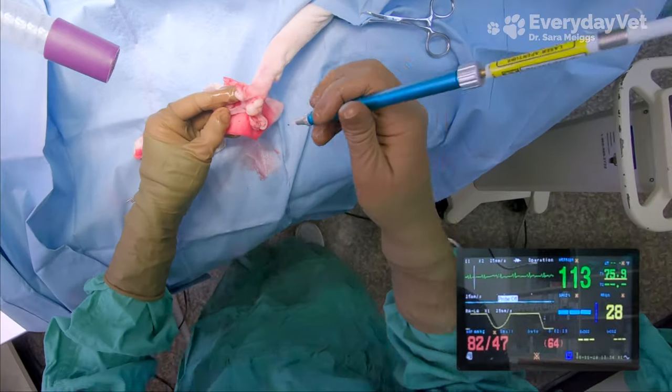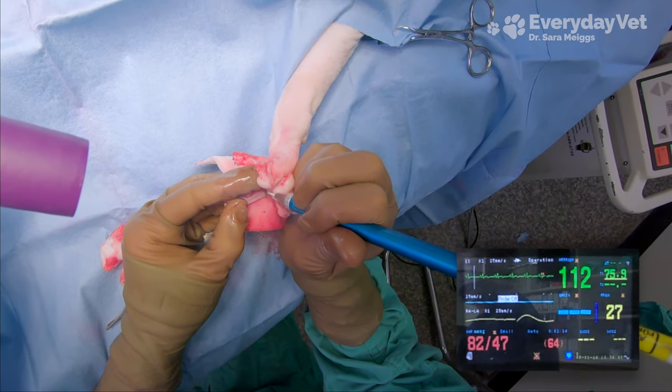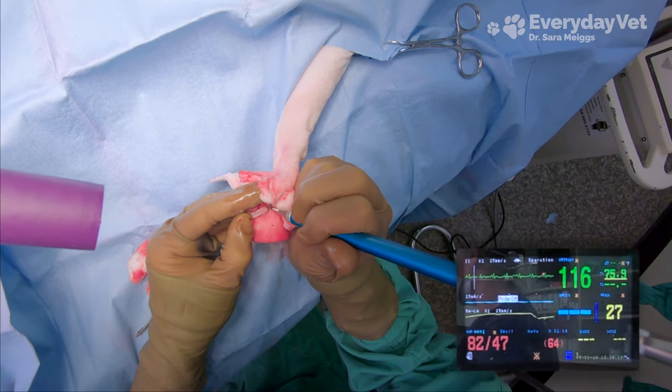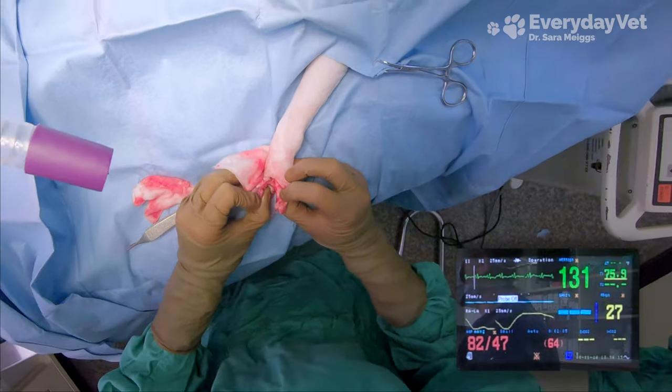Jumping back to that Cardell for a second — I was worried that we may need to increase his sevoflurane as I was dissecting along the sides of the toe, but we didn't end up having to. His blood pressure and heart rate are actually staying very stable, so that's great. He's doing really well under anesthesia.